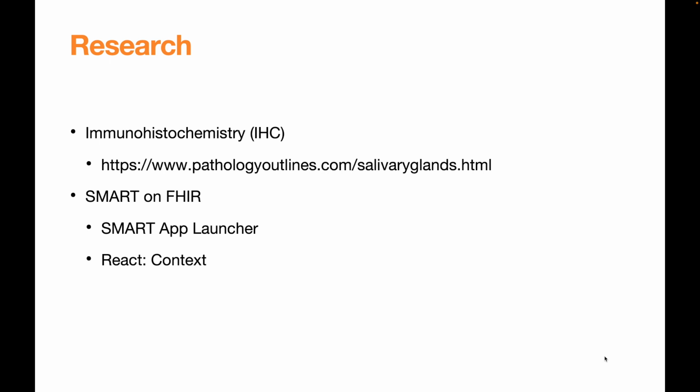Another type of research was SMART on FHIR. I had challenges with the SMART App Launcher as well as passing patient information across different pages. With the help of my mentor, I was able to overcome those two barriers by following existing examples. Next, I would like to give a demo of PathoStain Insight.